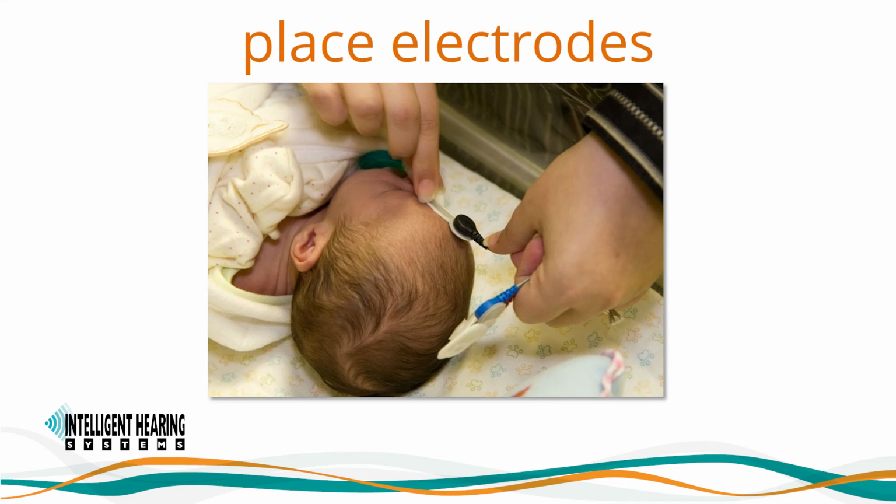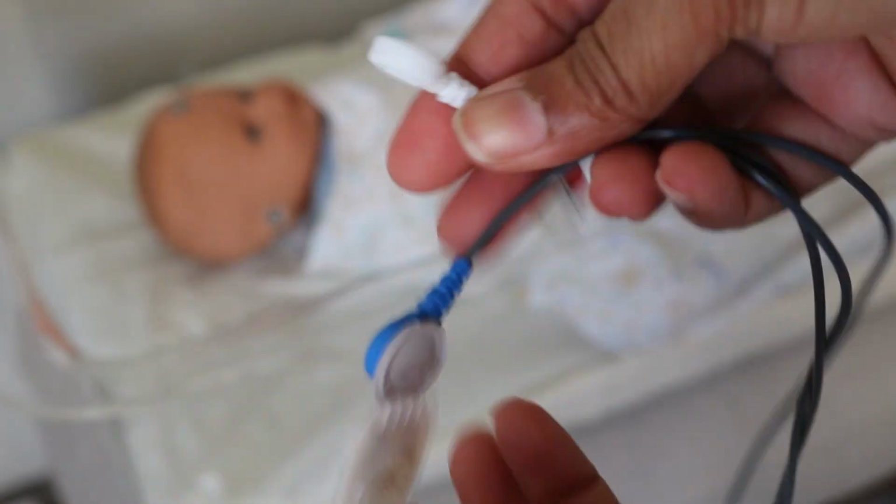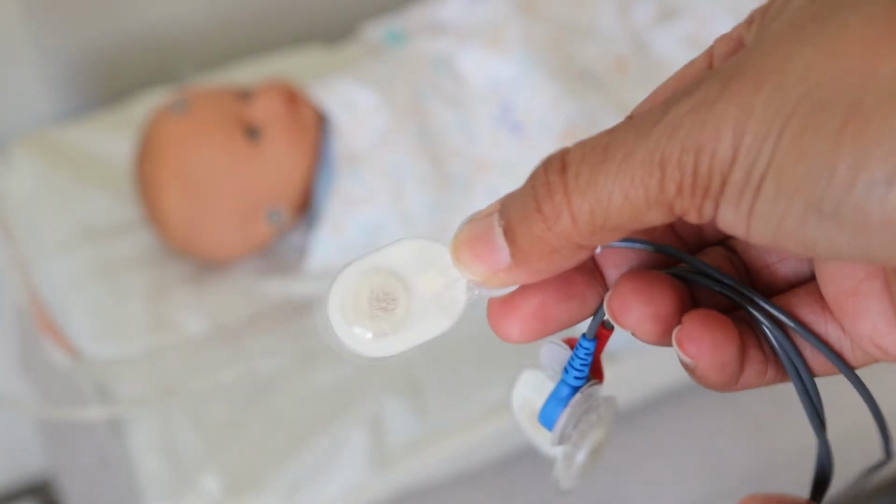No skin preparation is necessary, but make sure the skin is clean before placing the electrodes. Skin that is too dry, too oily, or flaky may affect impedance. Make sure the electrodes are kept in an airtight bag so that they don't dry out. The electrodes are pre-gelled and should not be dry before you start using them.